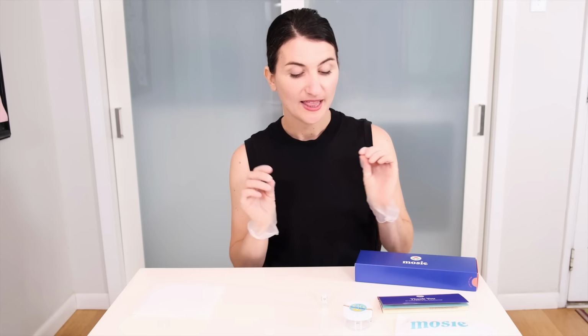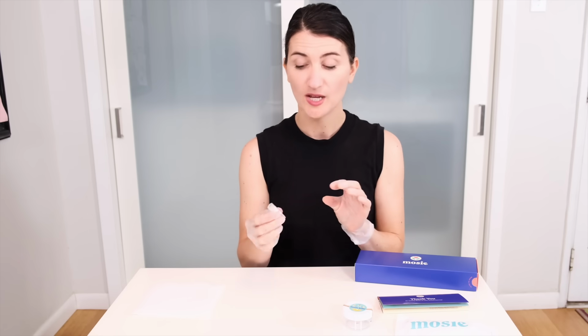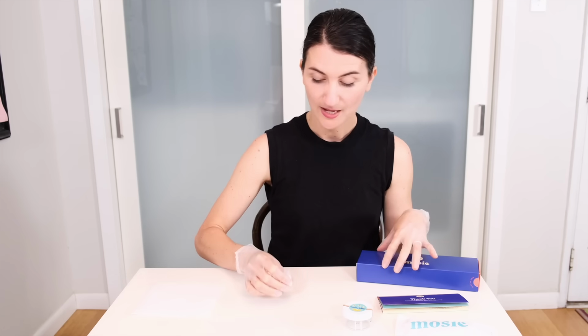So you're ovulating, you've got your vial, you've coordinated the shipment of that, but do note, side note, that a lot of the cryo tanks can last for a few days, a week, 10 to 15 days. So depending on your situation, your shipment, and your sperm bank, know that as soon as it arrives, you don't have to use it, that there's a little bit of window for you to time it with your ovulation.